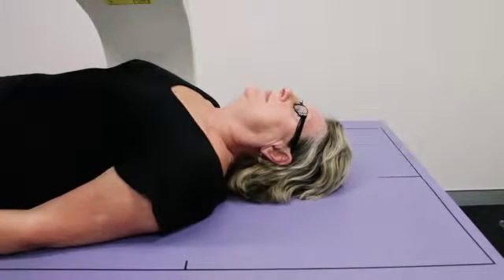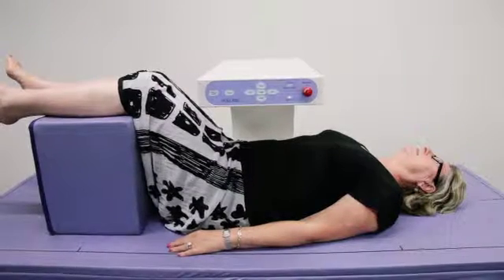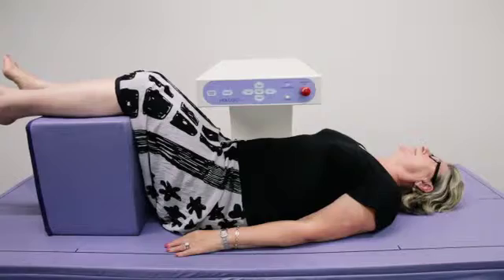Before we start the bone density scan, you'll note that the patient on the table is dressed in light, comfortable clothing. There will be no metal in the field of view for the lumbar spine or the femur. If there are any body piercings, they are also removed because they can also influence the scan.